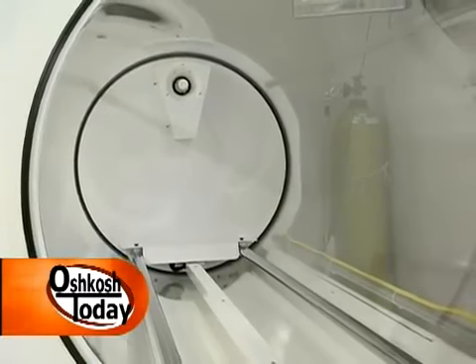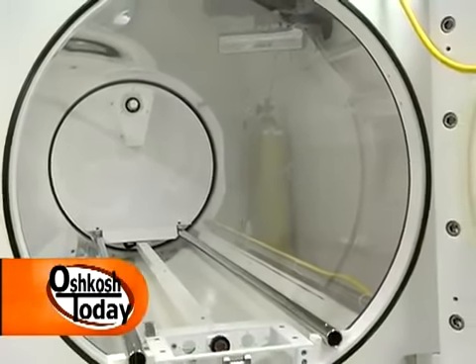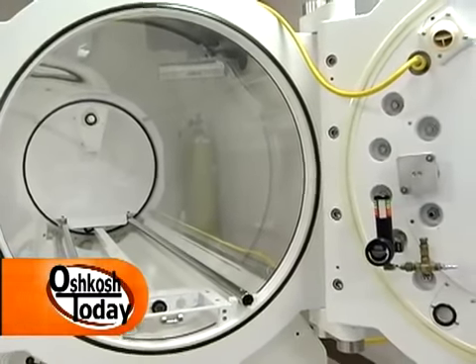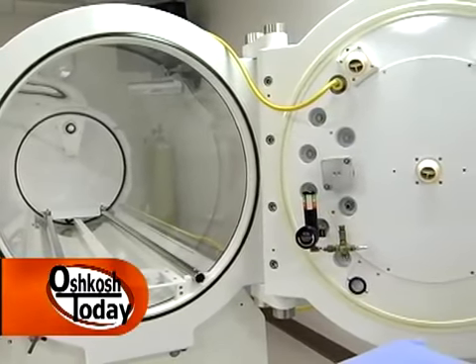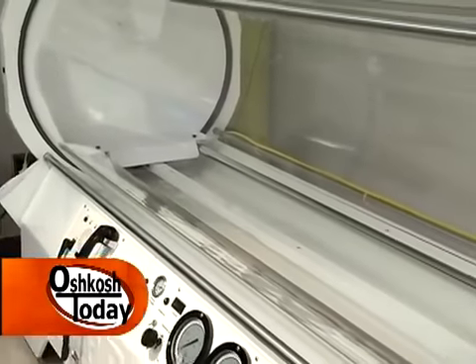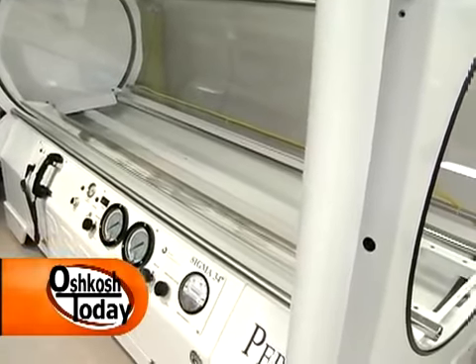Okay. And I would imagine one of the services that you offer here in the wound care department is this machine right behind us, the hyperbaric therapy. It is. I wish I could remember the statistics, but even 10 years ago there weren't a lot of units, and now we're really finding how useful it is in helping to heal wounds that might have otherwise, in the past, ended up with an amputation of your leg.